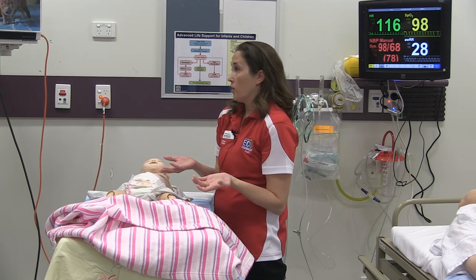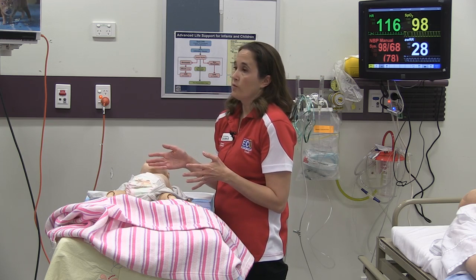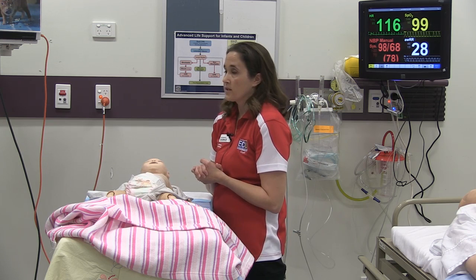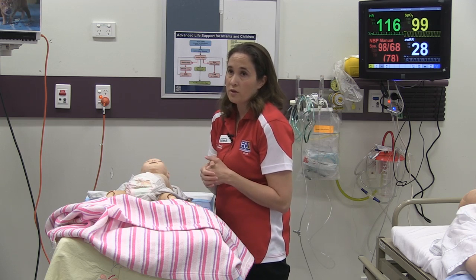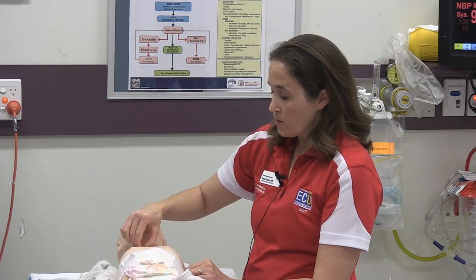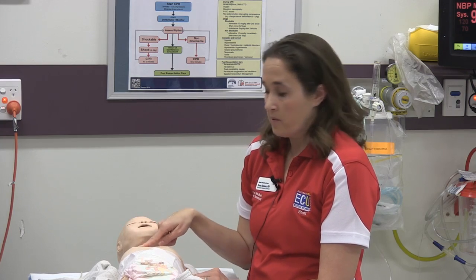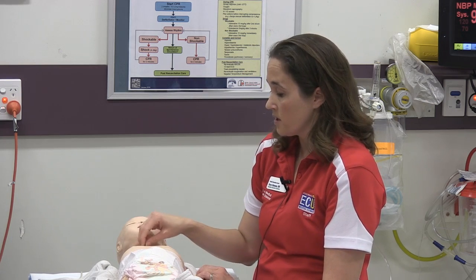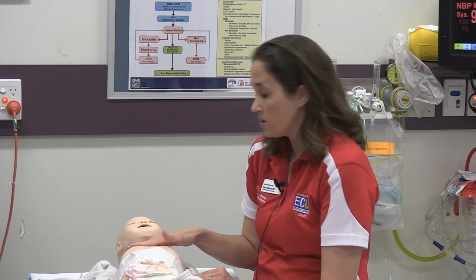If you don't want to give the scenario away, let them listen to a range of heart sounds. So they're not exactly led into what the scenario is going to be. You'll see that it has 2 posts here. That's for defibrillation of the baby. So you just will attach defibrillation posts. You can also use pads. This Manikin comes with discs that you can attach sticky pads to.